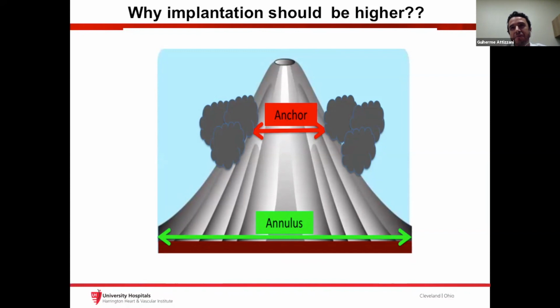However, the pre-dilatation was done based on those measurements that we just discussed a minute ago. So I wouldn't feel extremely comfortable going with a true dilatation balloon and dilating more aggressively, unless when I am at LAO, I see the valve extremely constrained, that expansion is impaired, then I would do that. Other than that, I don't routinely go RAO to see if the valve is expanded or not.